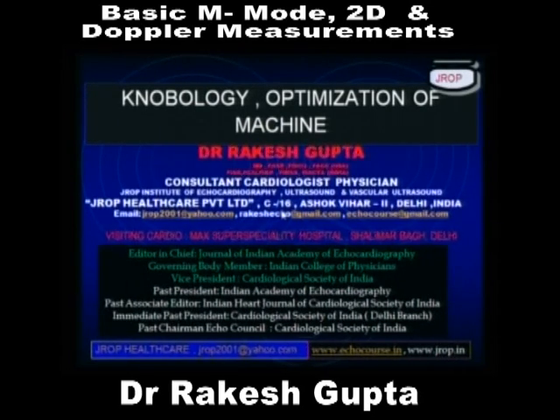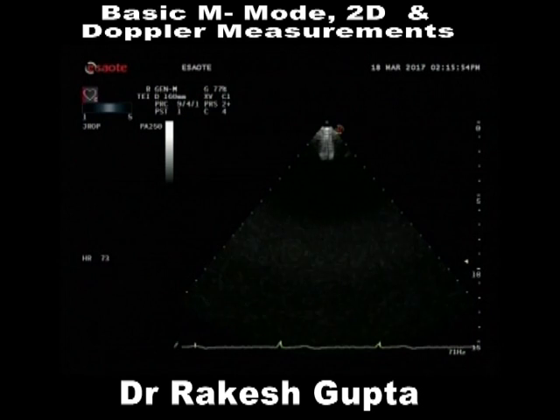Similarly, on a machine, can we shift on to the machine? Okay, change this to system. So once we label a color, once we determine a velocity, the same color will be depicted on the screen. And how does this color change?